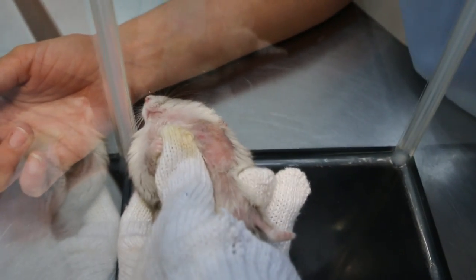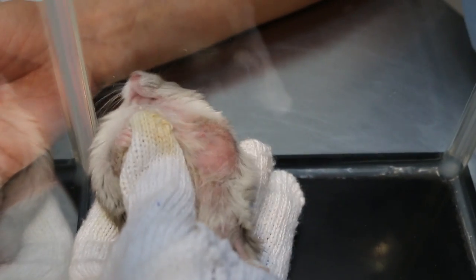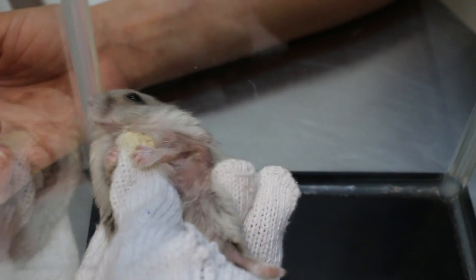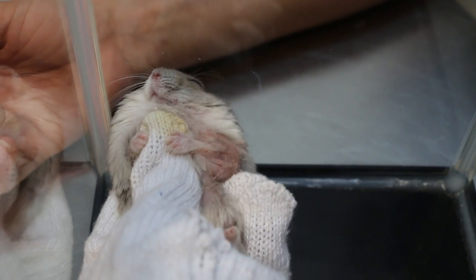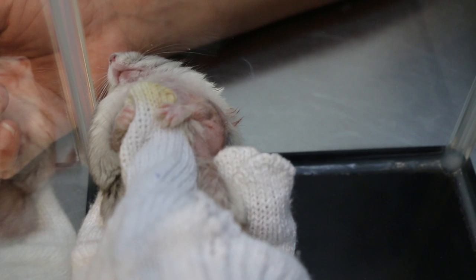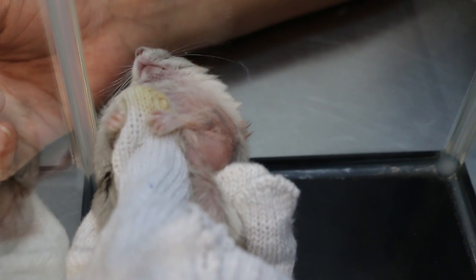Two hours after surgery, you can see there's not much bleeding on the wound — left elbow. You can see a small red spot on the elbow. Electrosurgery is very good because it burns, cauterizes, and cuts at the same time.